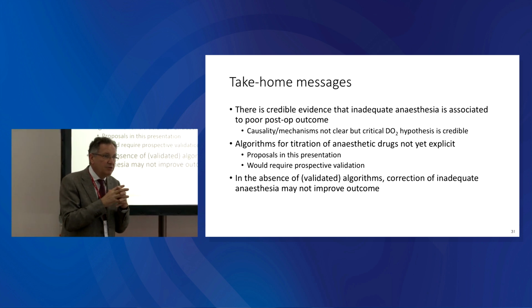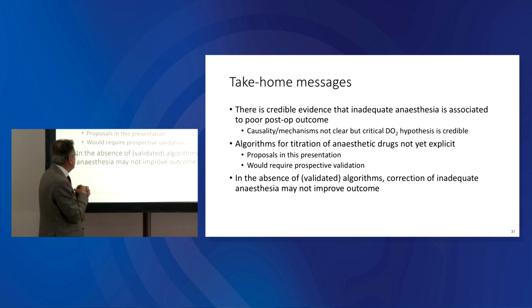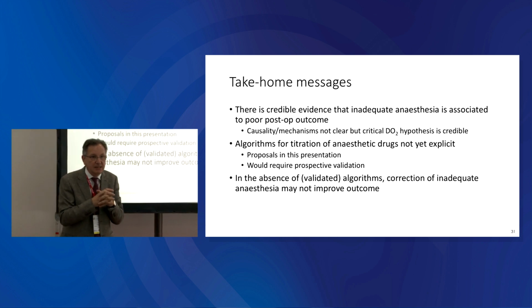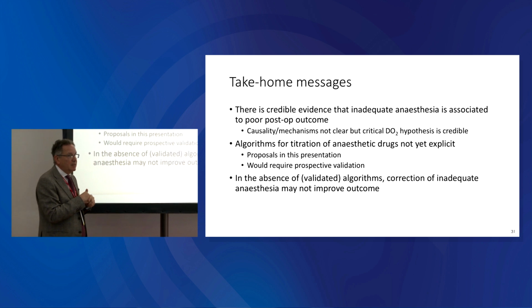And if that knowledge of pharmacology is not correct, I think that the whole system is going to be unstable. And I think that in the absence of validated algorithms, because they have not been properly validated, the correction of inadequate anesthesia may not improve outcome for many reasons.